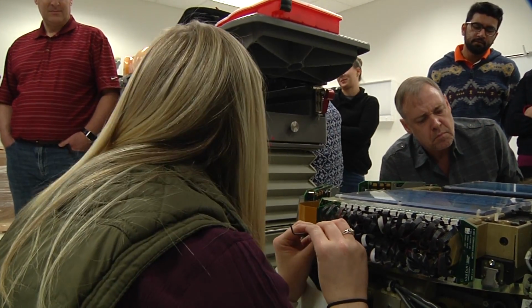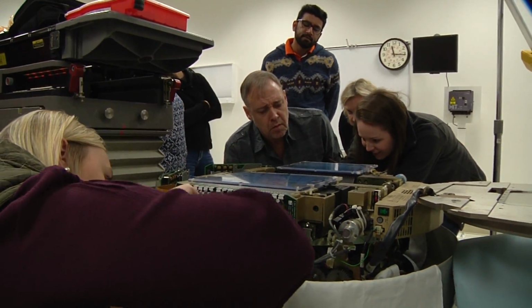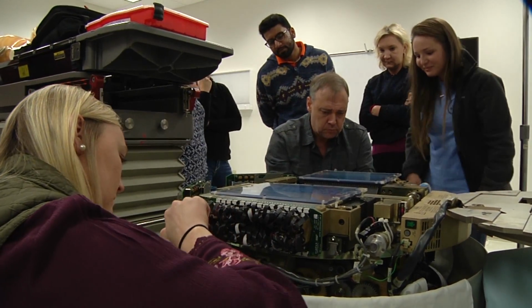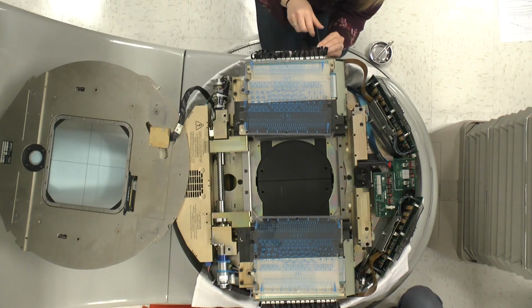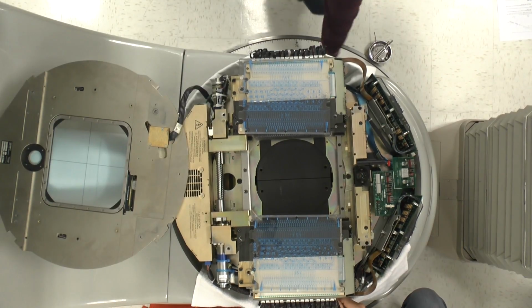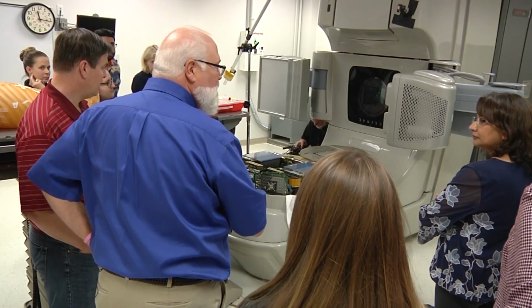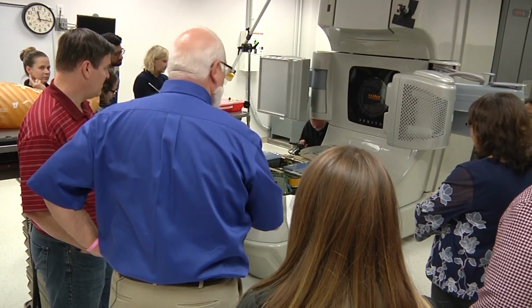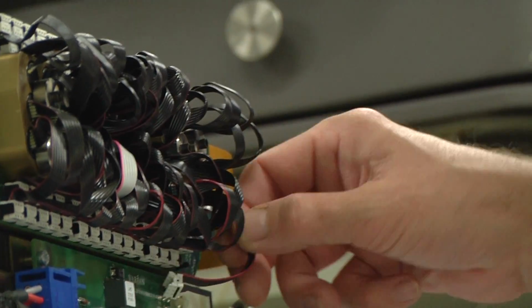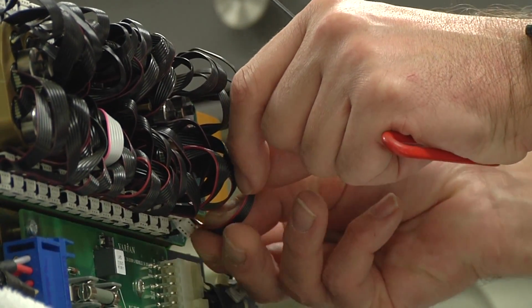So before you tighten it all the way down, check all the motors around it again. Okay, once you get yours in, Roger, we'll turn the power on, and we'll make sure that leaf 3 and 2 move okay. Good work. Your turn. Easy. It was easier than I thought it was going to be. The ends are much easier than the middles.